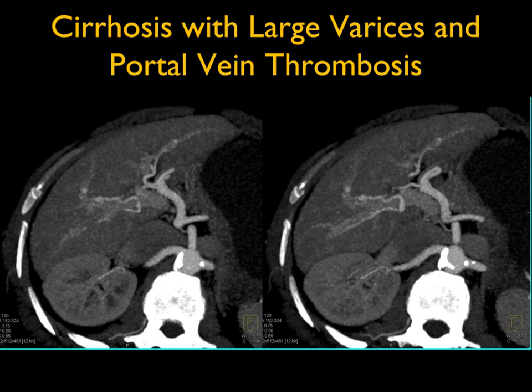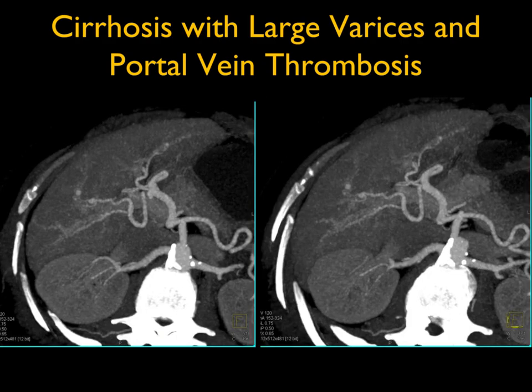Case seven: cirrhosis with large varices and portal vein thrombosis. In patients with cirrhosis you can see small micro-aneurysms off the hepatic artery and the liver texture is irregular. On arterial phase MIP imaging you won't see portal vein thrombosis or venous changes well. On venous phase imaging you see splenorenal shunting, assess the portal vein patency, the SMV, and note a gallstone.